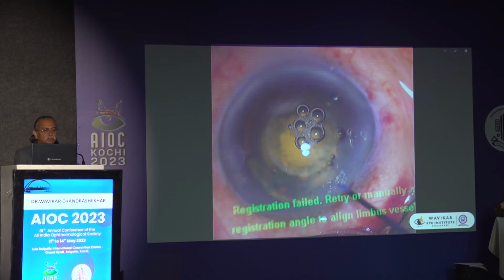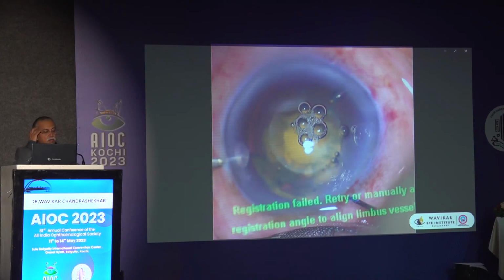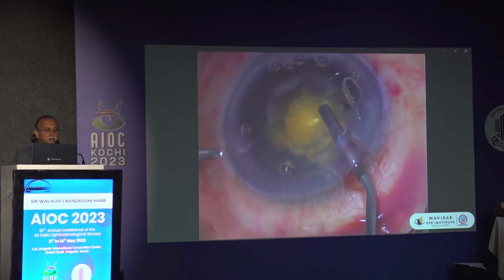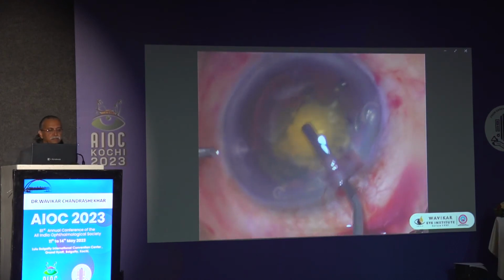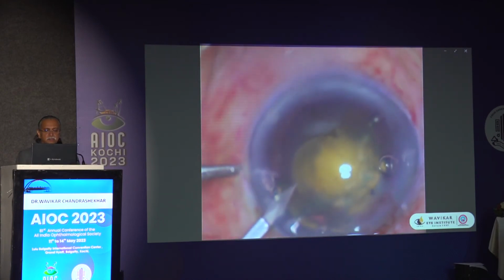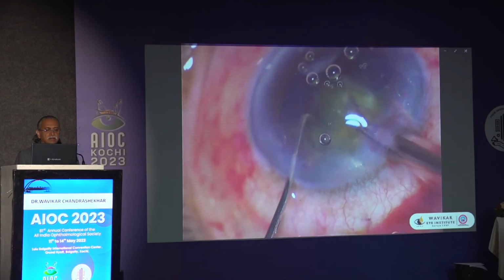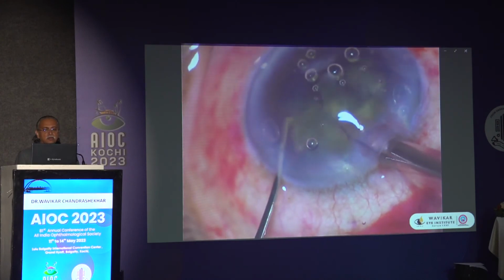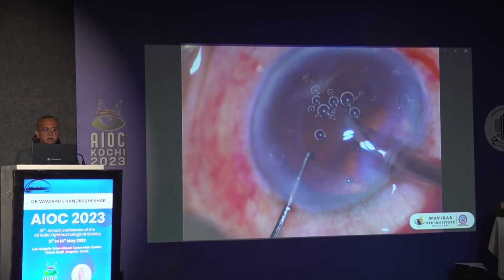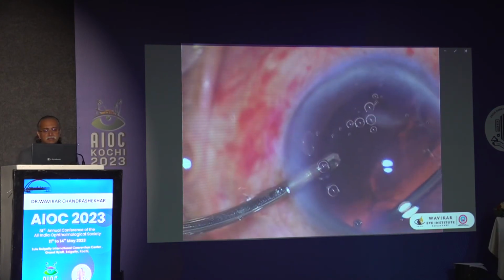It's because those two air bubbles are constantly present, this one and the second one, throughout the surgery. You can do all the maneuvers, and they will be present. Basically, that is the air bubble in the pre-Descemet's area. So I will take two separate side ports, ensuring that that area does not get touched at all, or even the fluid does not go there. I completed the phaco gradually, and even during IA and lens implantation, those two air bubbles are there.